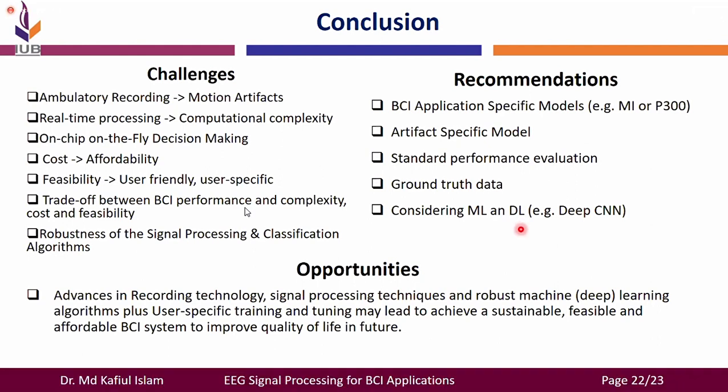system. And these days, it's the days of deep learning neural networks. So you're always welcome to try deep learning neural networks, because with deep learning you can avoid so-called traditional signal processing or feature extraction techniques. In my opinion, the future opportunities are that advances are being made in recording technology, in EEG headsets, from wired to wireless, few-channel EEG recording headsets, and advancement in signal processing, and also in more robust machine learning or deep learning model architectures.